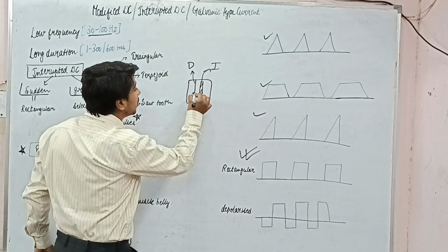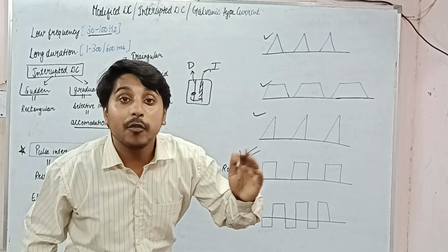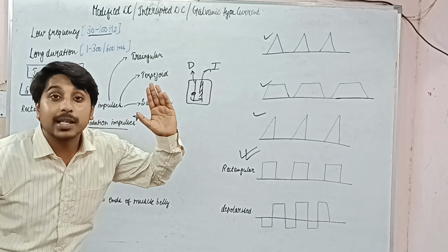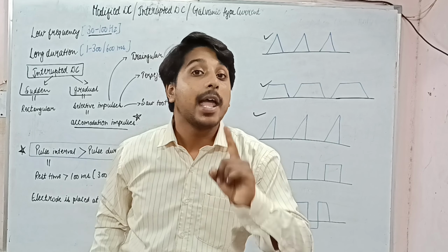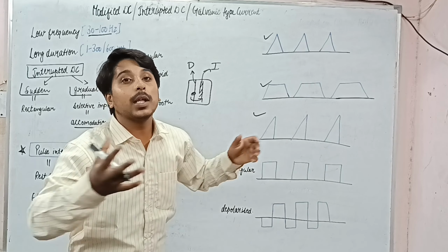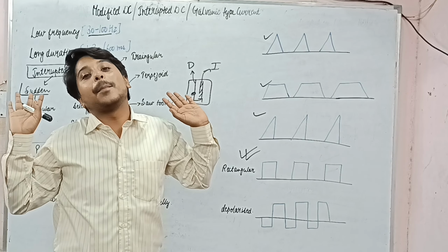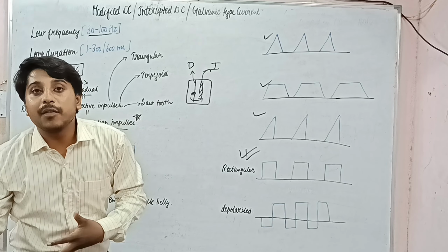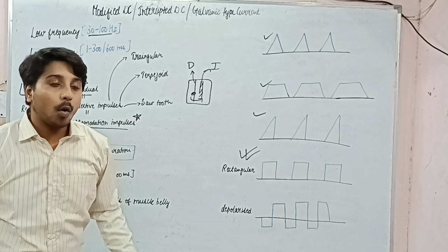When I apply current to this muscle, definitely some current can also move towards that muscle. And as my current is of slowly increasing intensity, the innervated muscle can accommodate. So whenever I apply the galvanic current to a denervated muscle using these slow impulses, the innervated muscle placed near the denervated muscle will accommodate and not get stimulated, which reduces faulty application. So it is good to use slowly increasing impulses because they help the innervated muscle accommodate and it will not respond. We will see the response purely from the denervated muscle.